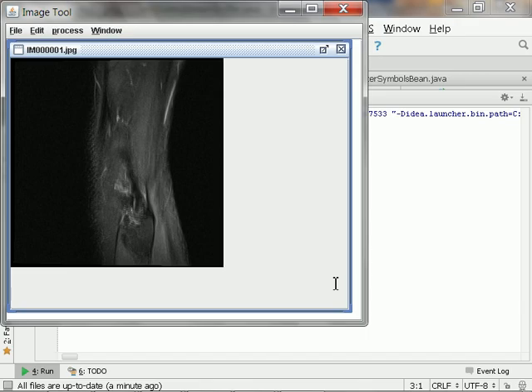Very interesting problem, right? Now, what can we do in terms of homogeneous point processing to my knee? How can we improve our ability to see what's going on here? You guys have read the book now, Chapter 4, Homogeneous Point Processing. Right?